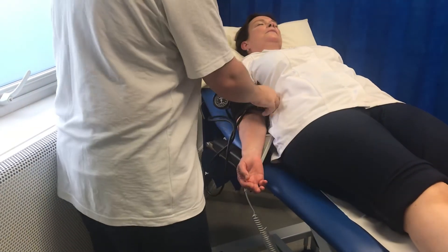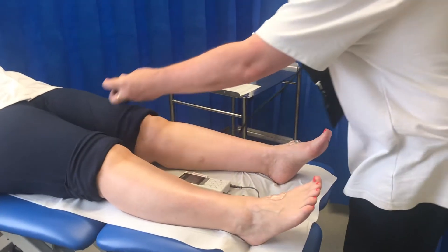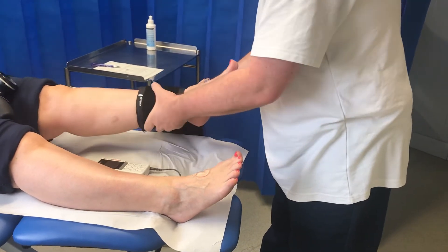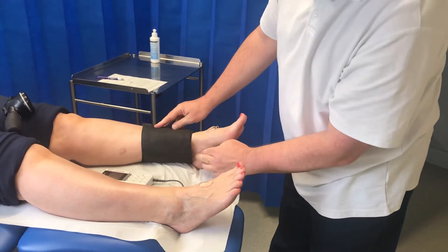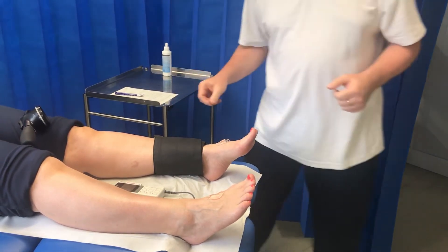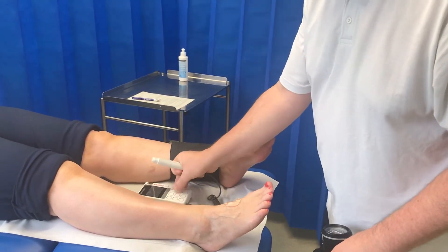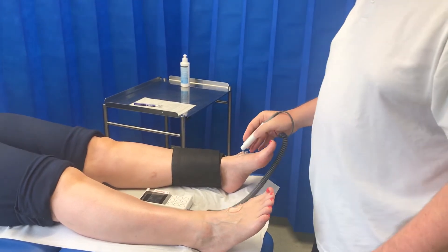I'll put my Doppler down, remove the cuff, and bring my kit down towards the legs of the patient. I'll explain that I'm now going to do the blood pressure on the lower limbs, and put the cuff on the first ankle about one to two centimetres above the malleolus. I'll write down my results from the previous brachial pressures and get my Doppler, putting it somewhere safe and stable. I'll now be looking for the dorsalis pedis pulse.